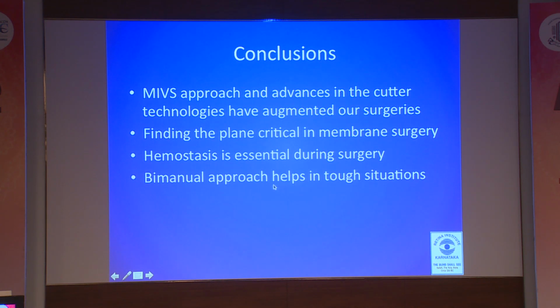And do not shy away from using the bimanual approach, because I've heard speakers say, I don't do any more bimanual surgery because the cutter technology is so advanced. I don't like to make statements like that. I do fall back on bimanual surgery whenever the going gets tough.